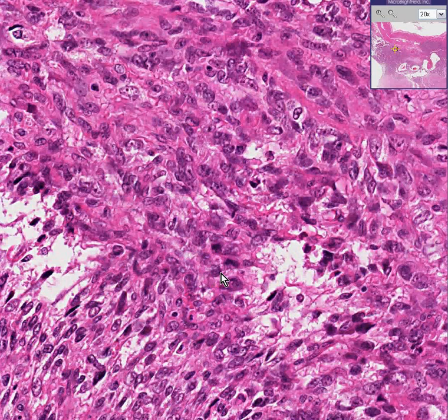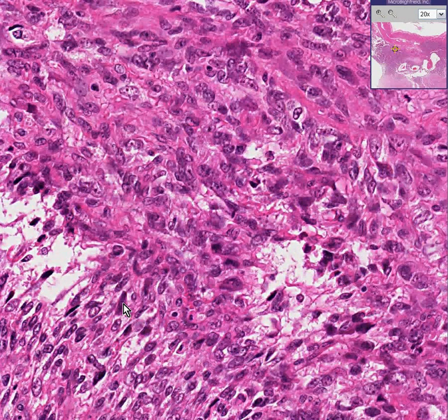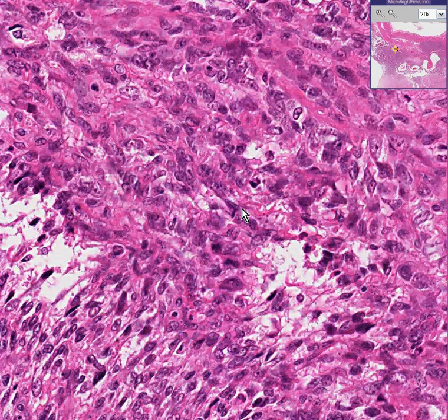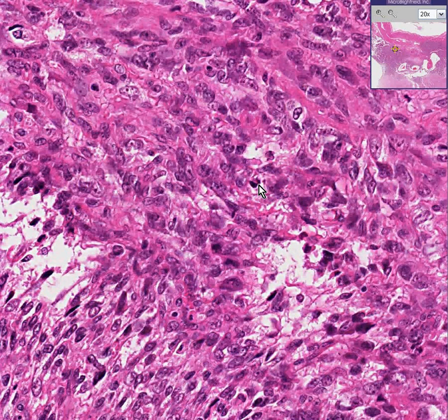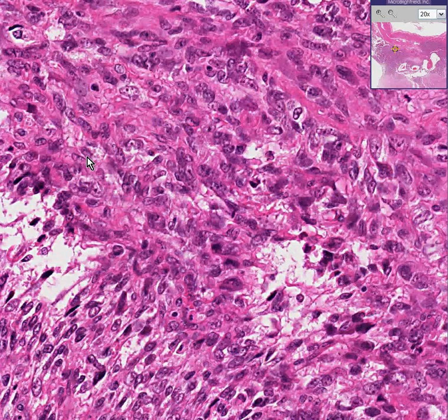Here's one mitotic figure. Here's one. Here's one. I wouldn't bet my life on this, but it could be another. So in this one field we have three, maybe four, maybe another one here, maybe another one here — mitotic figures. Whenever you see increased mitosis in soft tissue tumors, especially leiomyomas, that's the single number one criteria for making them malignant.